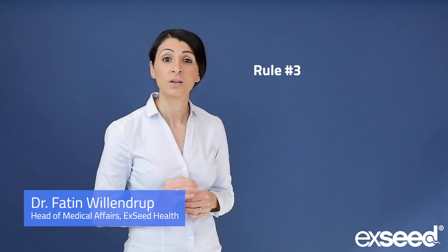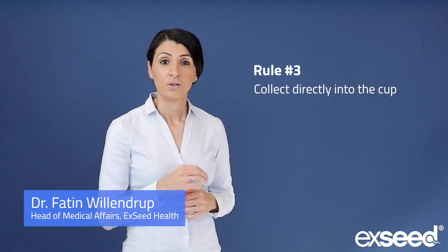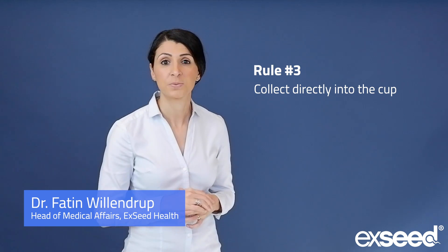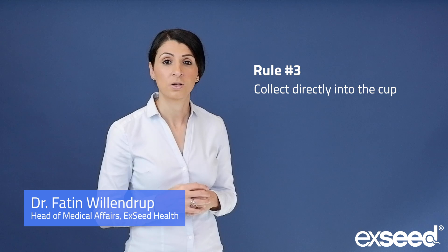Rule number three: collect directly in the exceed cup. You need to collect directly in the cup and not use any condoms or other collection cups. This is important, and also the first drops are very valuable.